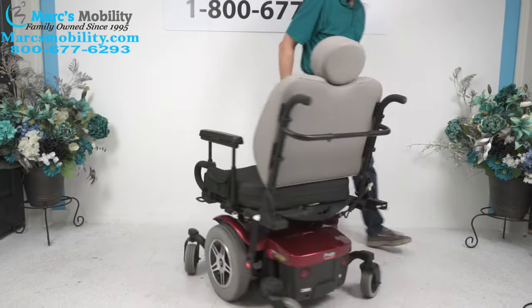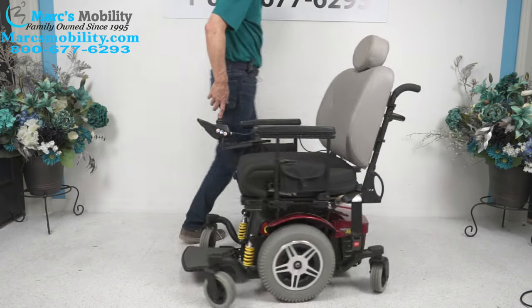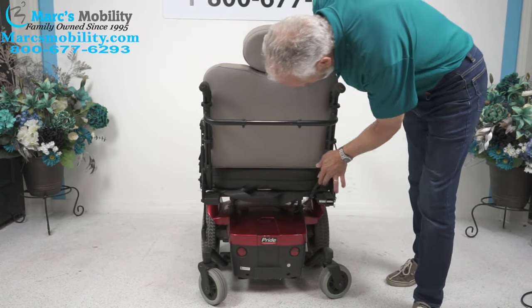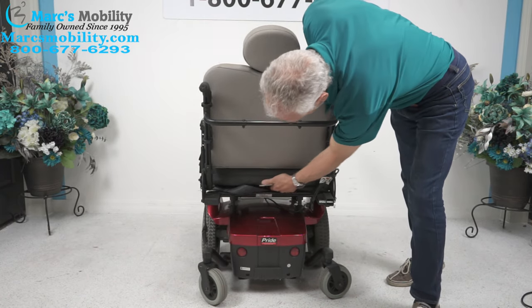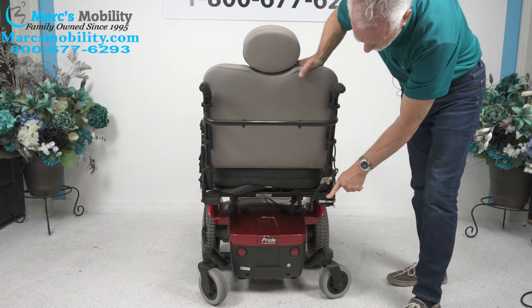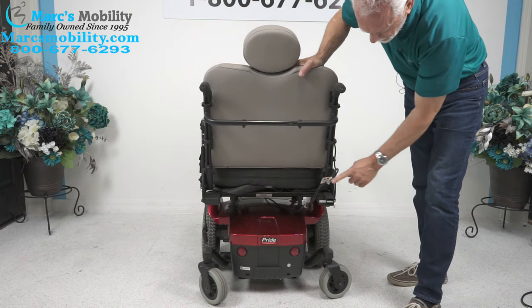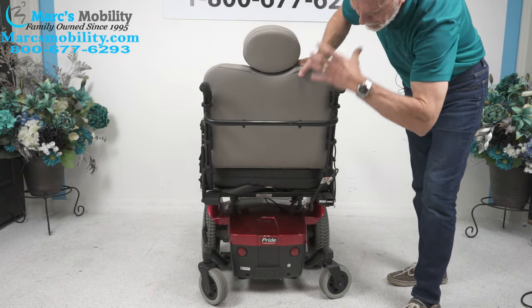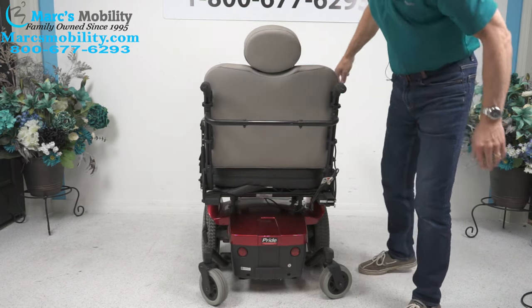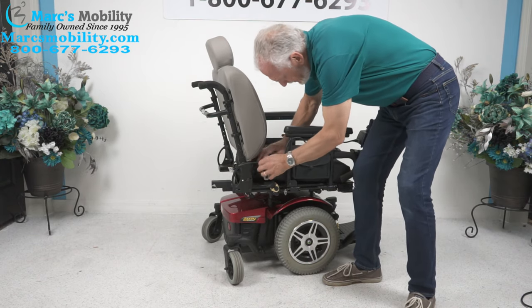This is a mid-wheel drive chair, so it turns on its own length — you can do a full turn in a very small space. Back here is a docking device for a basket or an oxygen holder. If you put a basket it's going to stick out quite a bit, so this is most likely used for an oxygen holder, which would sit more in this position.